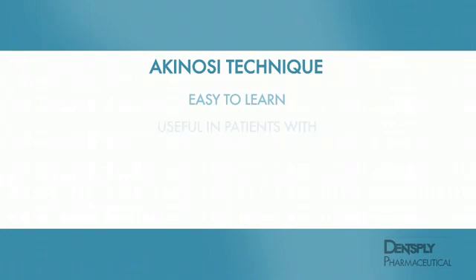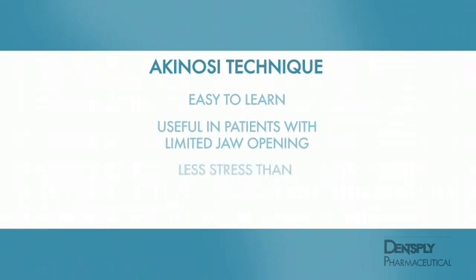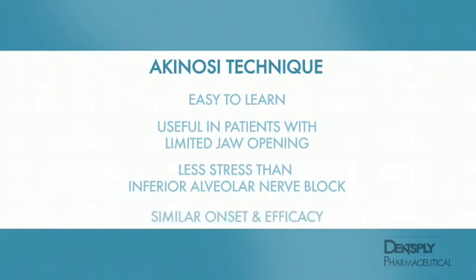Although the closed mouth technique is essentially a blind injection, it is technically easy to learn and of great advantage in the patient with limited jaw opening. It is also perceived by some patients as less stressful than the standard inferior alveolar nerve block, yet comparable in onset time and anesthetic efficacy.